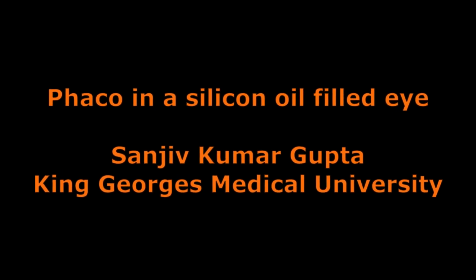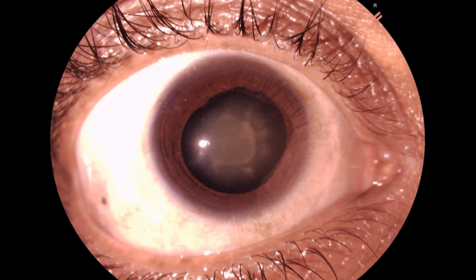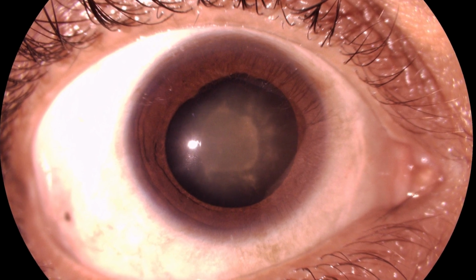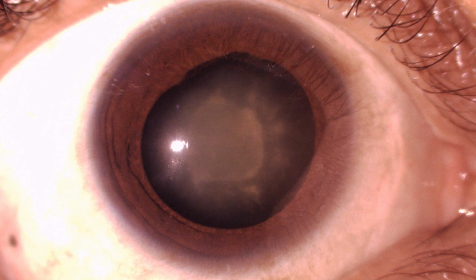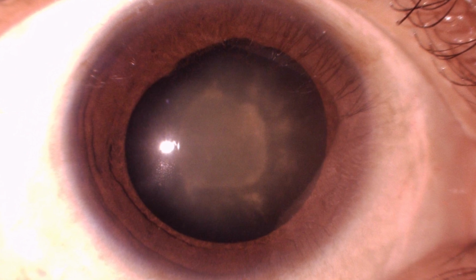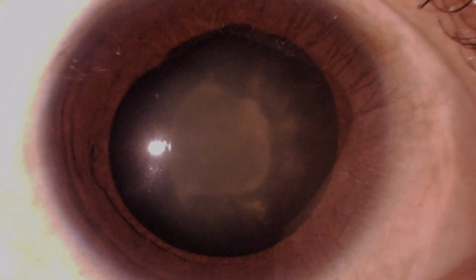Today this is one cataract surgery which is slightly different from the routine cataract surgery because this patient had silicone oil filled in the eye cavity. So there was no plan to remove the silicone oil, and this is the appearance of the cataract, and we can appreciate that the patient has a significant amount of nuclear sclerosis, and specifically there is a plaque on the posterior capsule which is commonly seen in these eyes which have silicone oil, and there is some amount of posterior synechiae as can be seen in the superior nasal part of the iris.